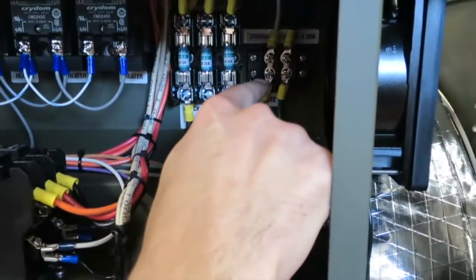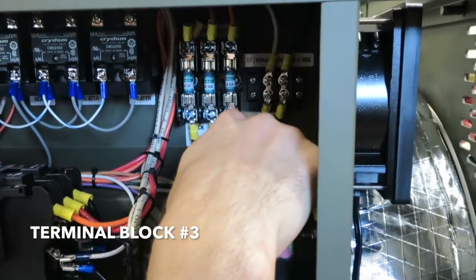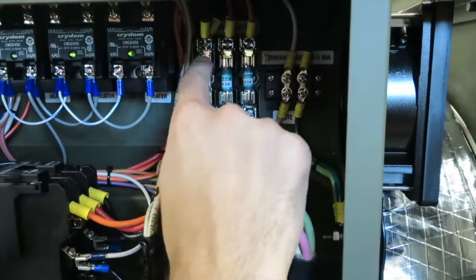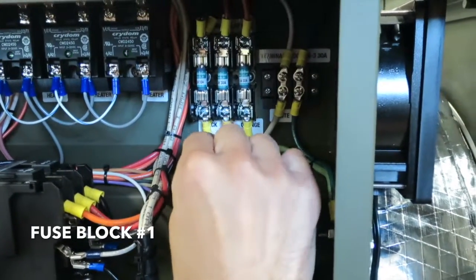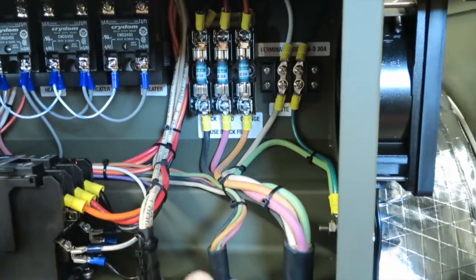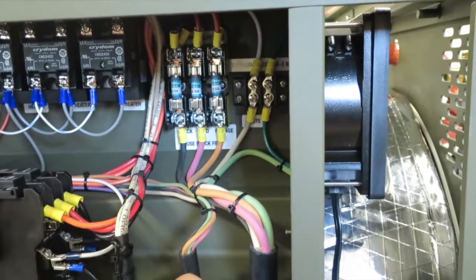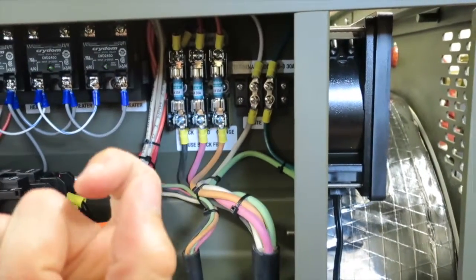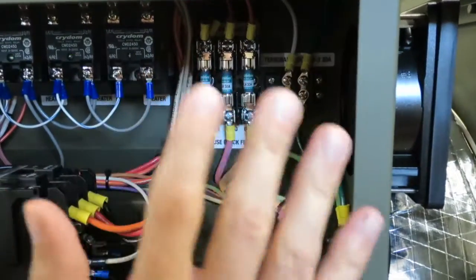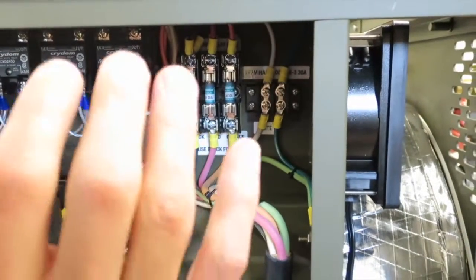Right here we have terminal block number 3, which is just to connect the neutral and the ground, the green wire. So that is terminal block number 3. Right here we have fuse block number 1. So these are 30 amp slow blow fuses. They're all the same. There's one fuse per phase of 208 coming in. So we got 3 of those. Those just kind of lock in and out and you kind of pry them out. But again, remember never to touch this area if the unit's on. All that maintenance has to be done with the sterilizer off and power disconnected.